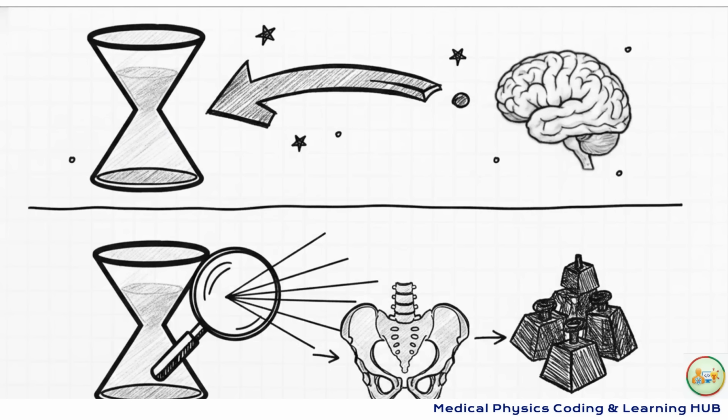So how do they actually process all this data? Well, a standard UNet uses an encoder to pull features from the MRI and a decoder to reconstruct the CT, passing info through what we call skip connections. It's simple, fast, and super stable. The downside is that it can sometimes output slightly blurry images when the anatomy gets really complex.